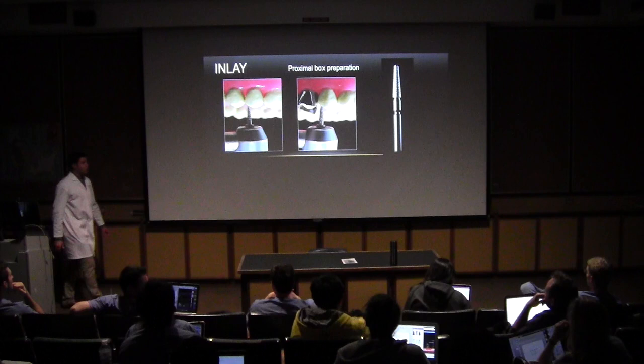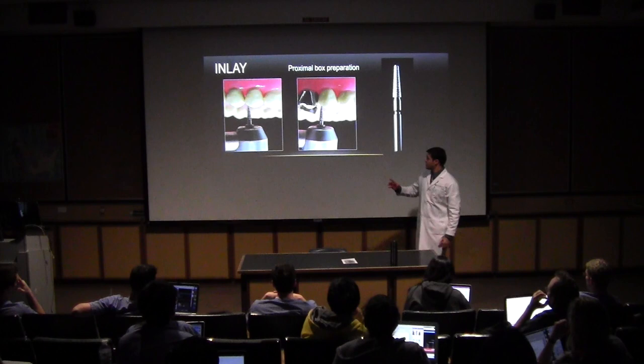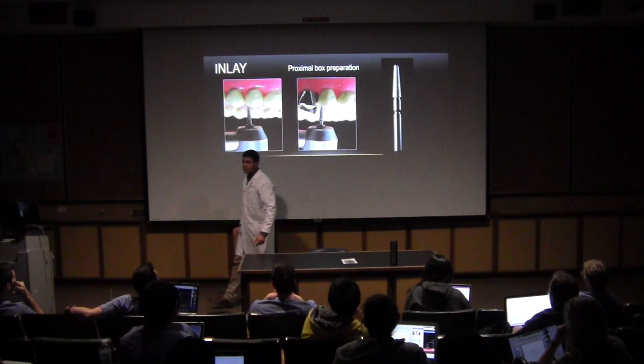So after shaving down the occlusal box, we go and work on the proximal boxes. Always remember to put the matrix and the wedge to protect your adjacent teeth, because normally we will have two, on the mesial and the distal. Always remember to put the wedge and the matrix to protect your adjacent tooth.